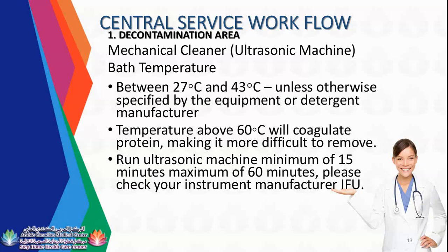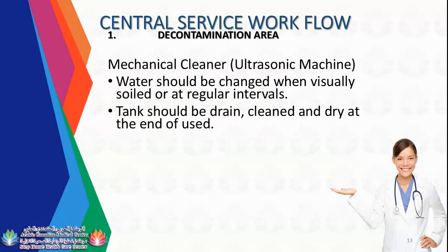Every instrument we receive, every machine we receive, we need to check the IFU. There are different types of cleaning processes for every instrument. There are different ways of operating the machine. So, we need to follow the IFU. Water should be changed when visually soiled or at regular intervals. It is mandated to be changed daily.